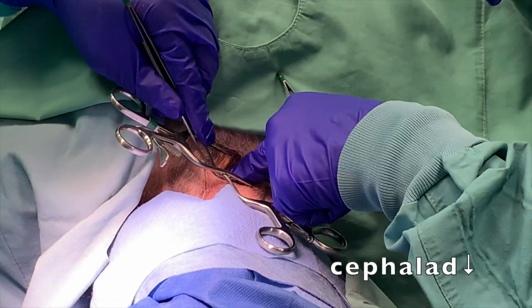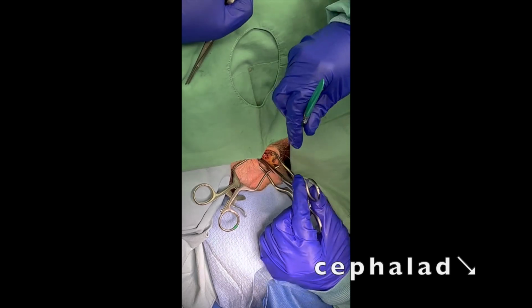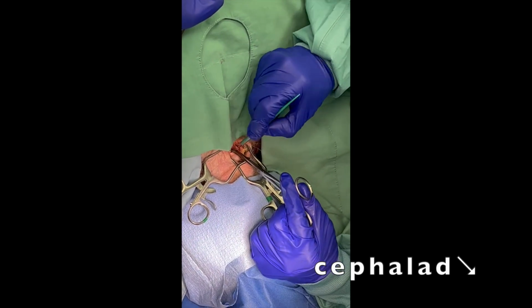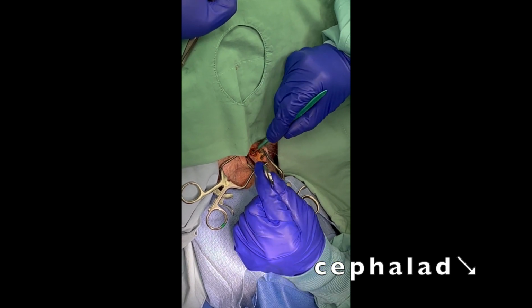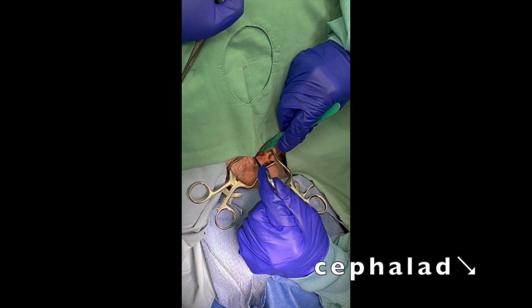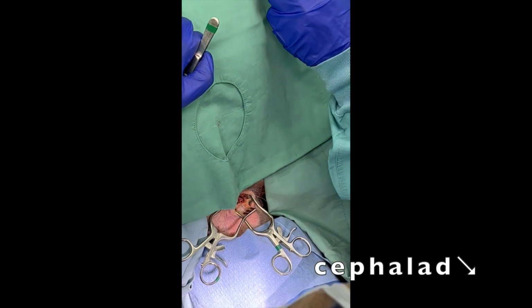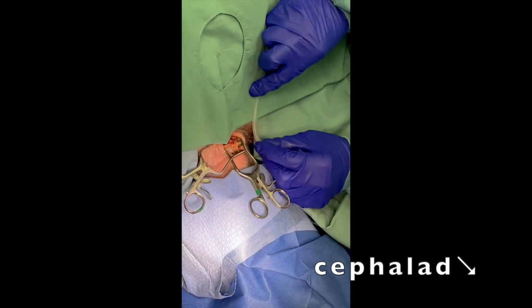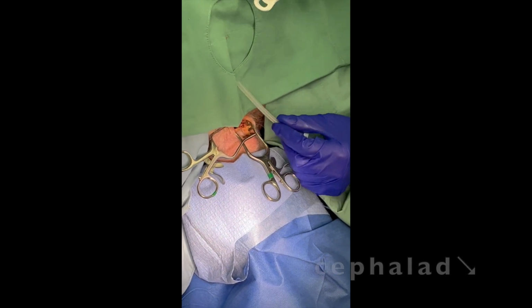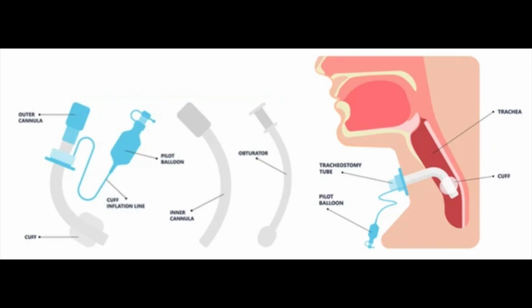Once the trachea is exposed, feel for the space between the 2 rings. Use the scalpel to mark a square, not cutting all the way through. Now, prepare the team by notifying them that you are going to make the tracheotomy incision. Grab the edges of the square with 1 Allis clamp and have more ready. Tell the anesthesia provider to pull back the endotracheal tube to avoid cutting the balloon. Then, complete the tracheotomy by cutting a full thickness square into the trachea. You will need to be quick with this step, as the patient now does not have a secure airway.